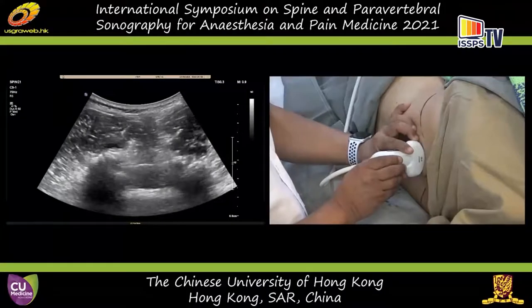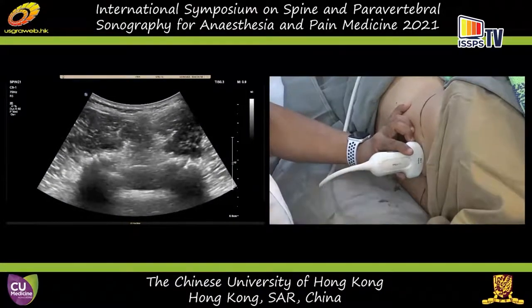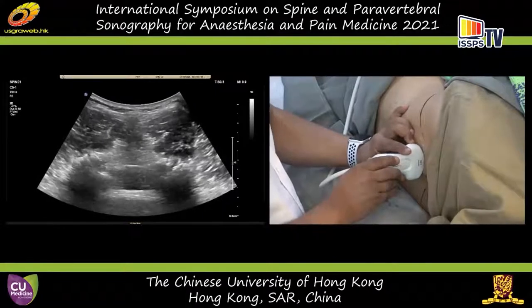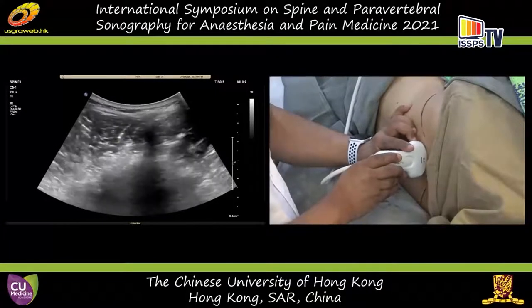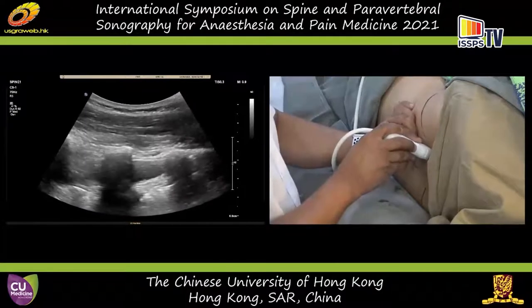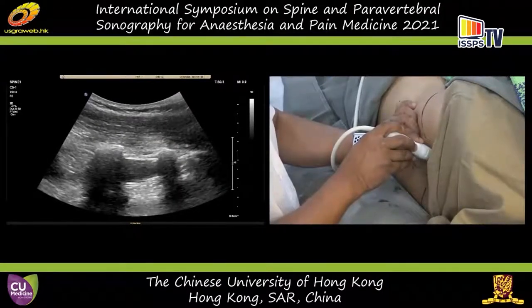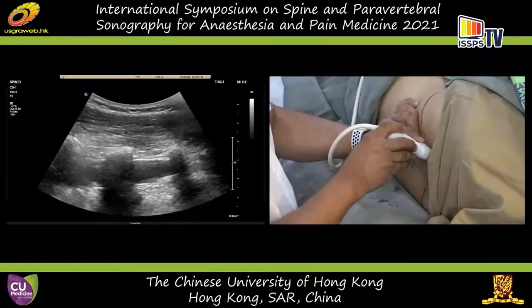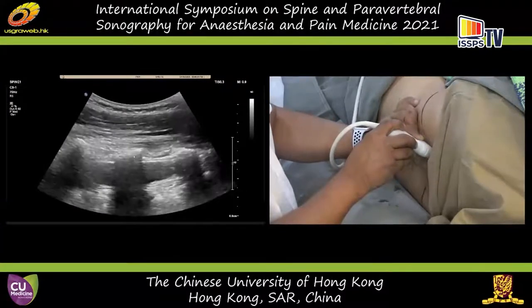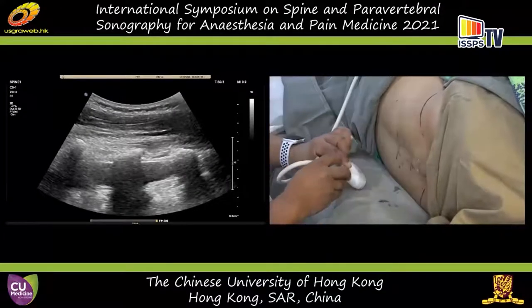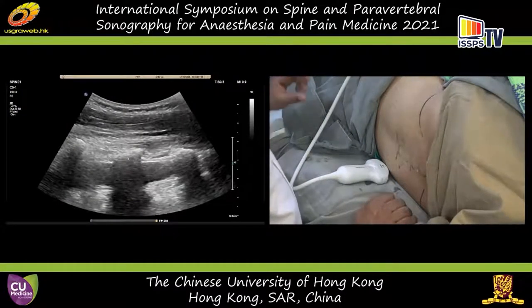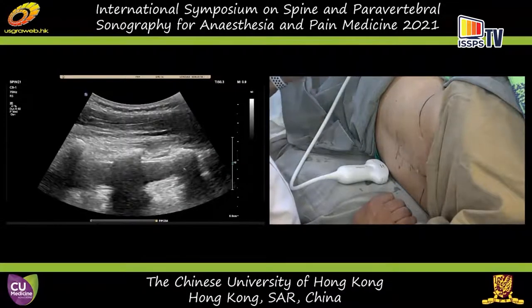These are some of the effects. Ultrasound imaging using curved linear transducers with a good machine where you can optimize the image appropriately goes a long way. Finally, I'd like to show you the position of the L5-S1. We have L4-L5 and S1 here. It appears that the thecal sac is narrowing towards L5-S1.